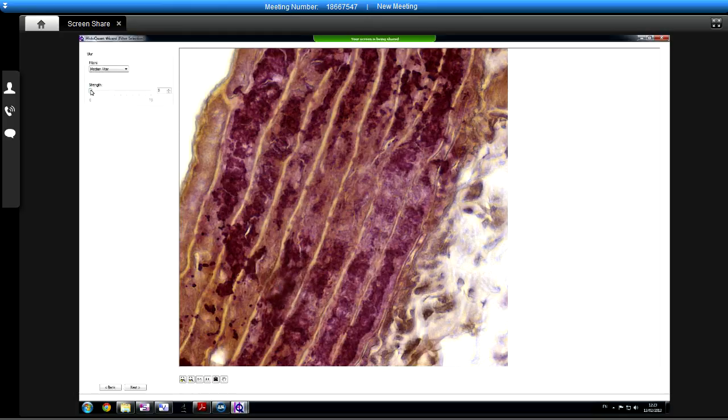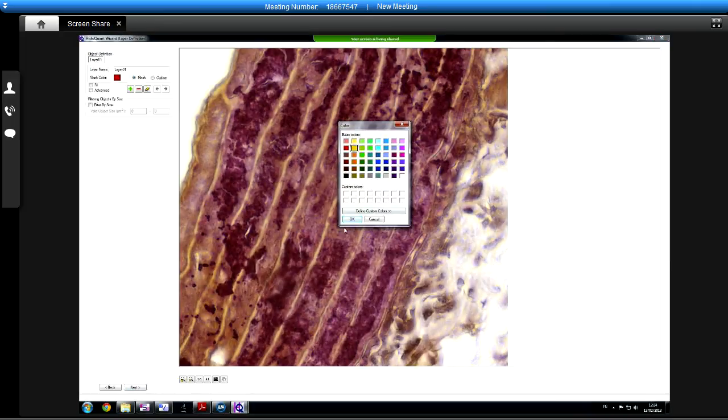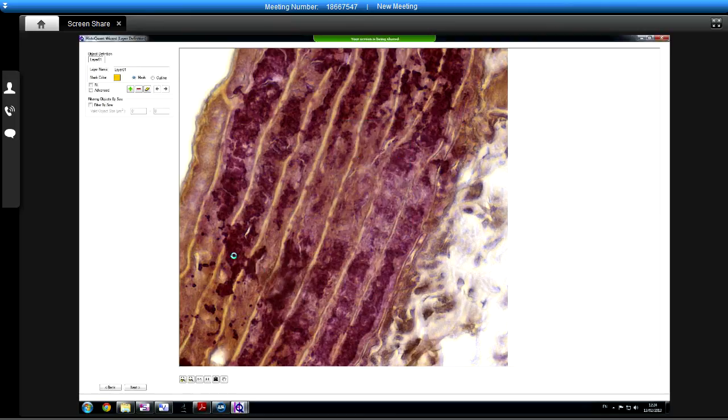What does that do here? Okay, let's leave those up for now. This is all true though, isn't it? Is there any negative here?